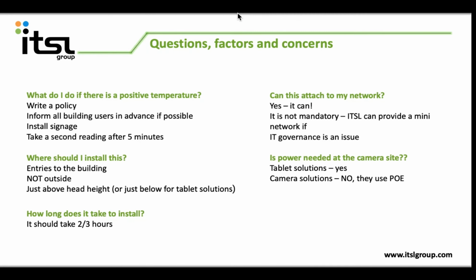Shall I take the next one? Where should we install? Yeah. Absolutely. It's always suggested, obviously, as close to the entrance of the building as possible. So the more you manage the temperatures of people coming into the building before they get far into it, obviously that makes sense. Location dependent, not outside.